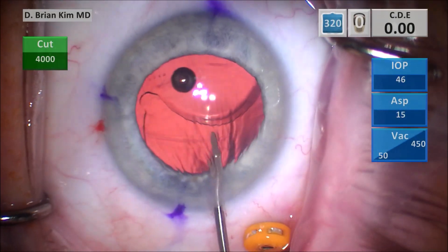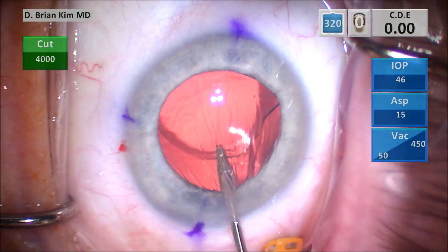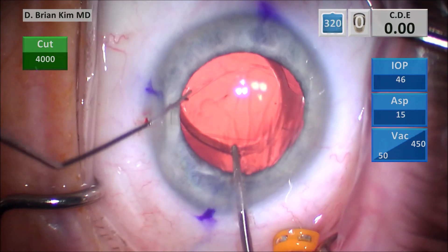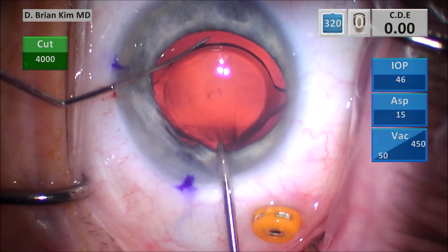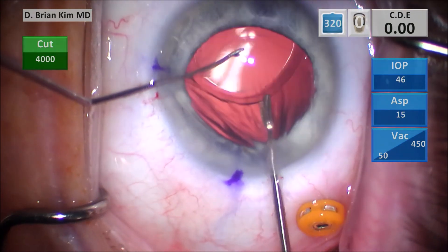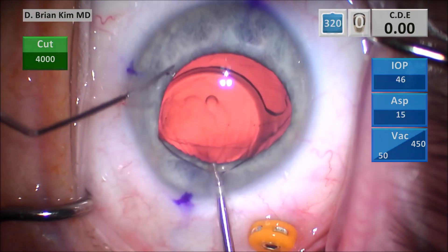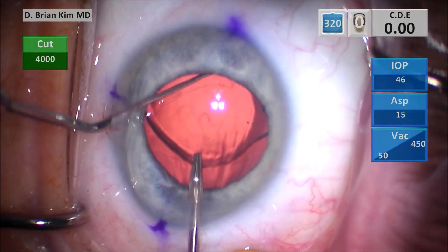This is my IOL holder — it's got serrated teeth, and it's going to be important because I'm going to try to reverse optic capture this lens. I'm using the Maltzman instrument to stretch the capsule, but what happens is when I do that, it causes the IOL to be pushed downward. You want to be very careful because stretching the anterior capsule risks accidentally tearing it — once that happens, I'd have to abandon this maneuver. So I'm very carefully stretching the anterior capsule, trying to get that optic upward.